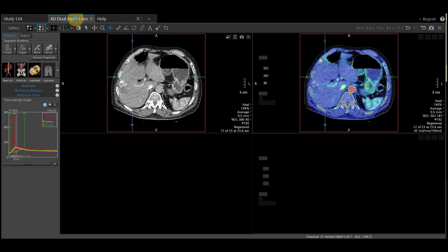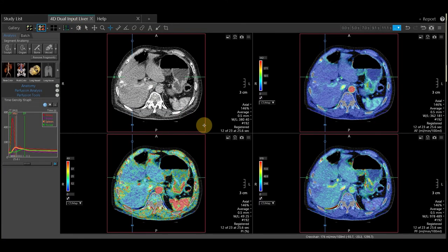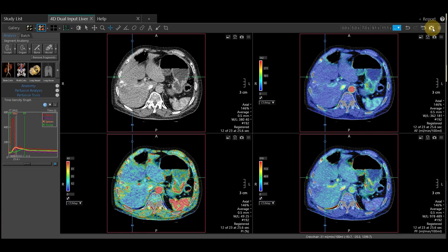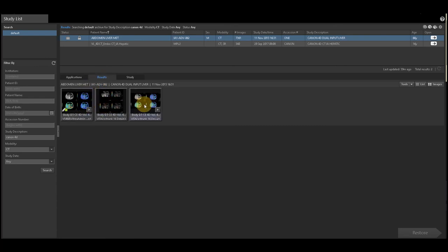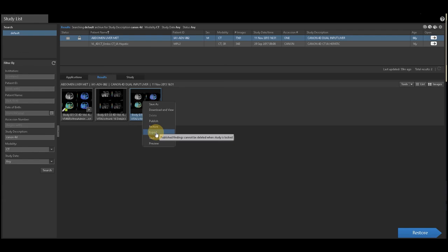You can go back to your application while the help tab is still open. A single click on the camera in the main toolbar will take a snapshot. When you are all finished, close the tabs to bring you back to the study list. Any batches or snapshots are saved under the results tab, which can then be exported to PACS by right-clicking and opening your export page.